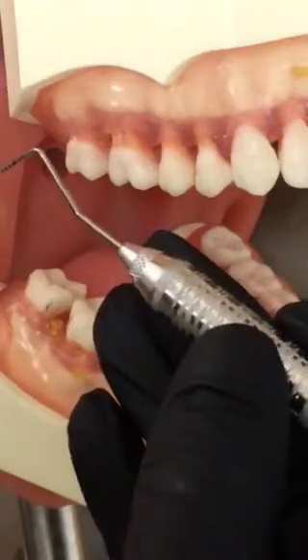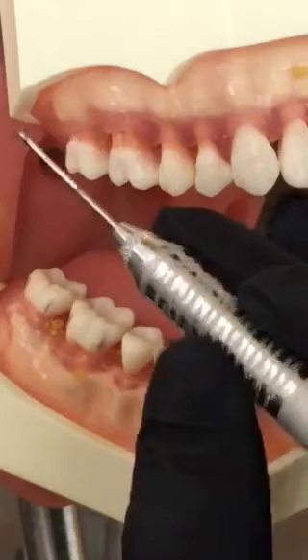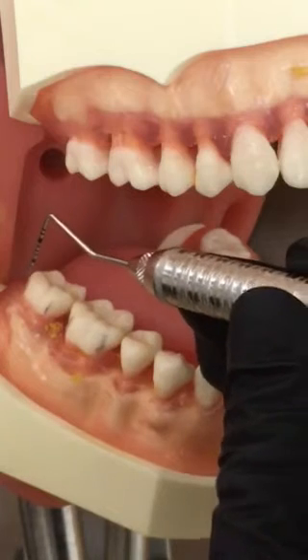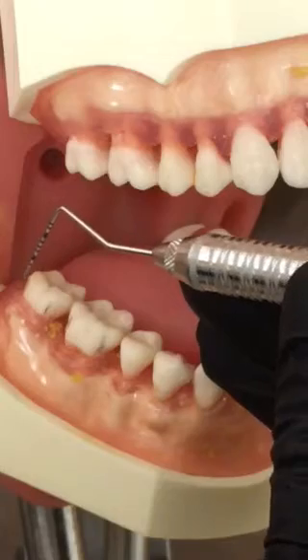I'm going to establish my modified pen grasp and fulcrum, making sure I have my fingers far enough so I can roll gently. I'm going to be applying little to no pressure. I want the probe to just gently glide into the sulcus, stopping at the epithelial attachment.